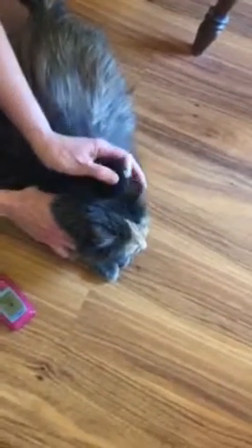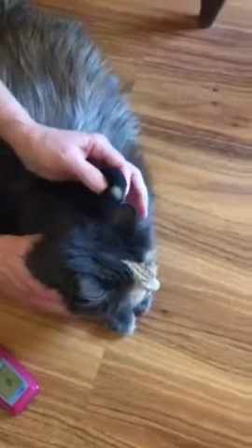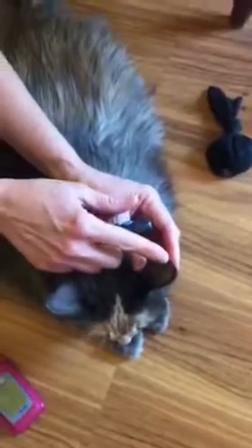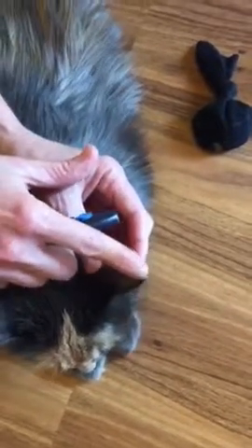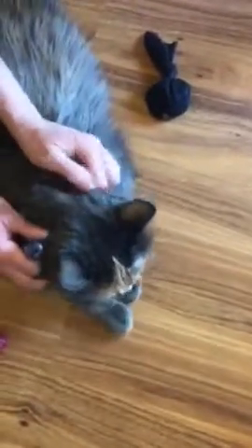I'm not going to hold this up to her ear because I don't want to burn her — it's way too hot. Normally I would hold it up until her ear feels warm to the touch. Because it is warm in here today I probably don't even need this. It's very hard to see her vein, so I kind of just take a wild guess, but what I'm aiming for is the dark part of her ear because that's where her vein is. You can see she's marked up because we've been doing this sugar dance for almost three years now.